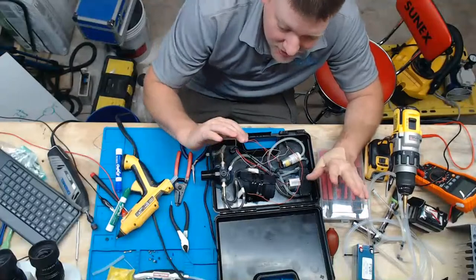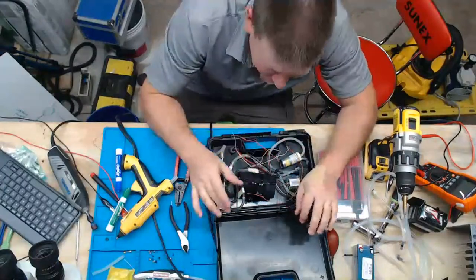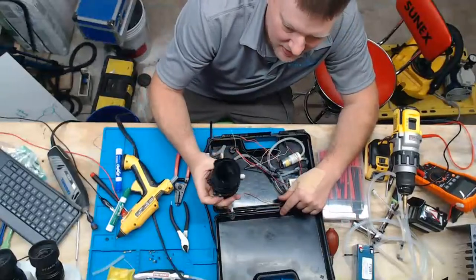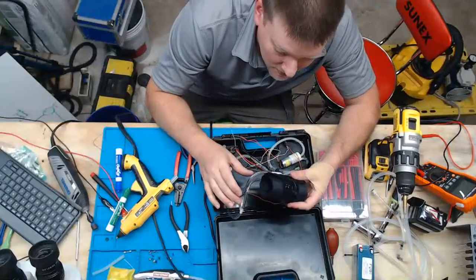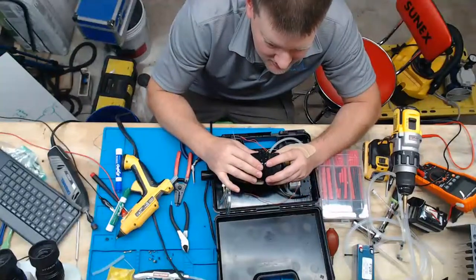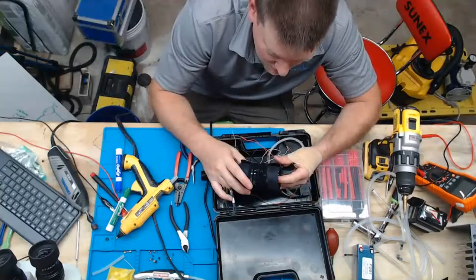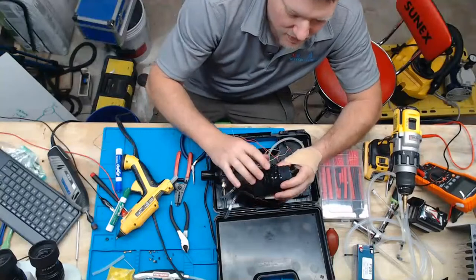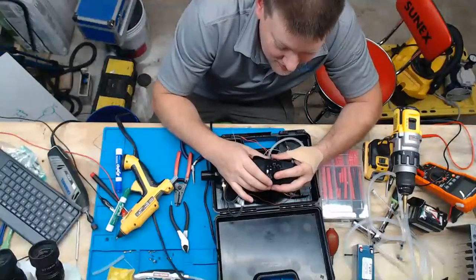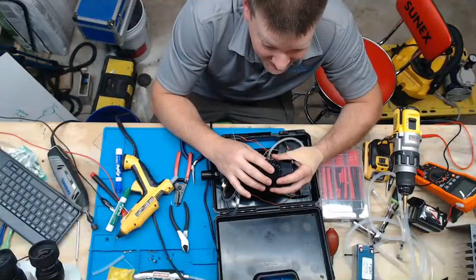And at that point, trust me, I am shutting the stupid thing down, because if I completely occlude it and it's going over 20 PSI, this guy right here becomes like a little bomb. Because that kind of pressure is just insane on a soft pressure reservoir. So I've got all these zip ties wrapped around it for a good reason, because it has exploded once or twice on me already today.